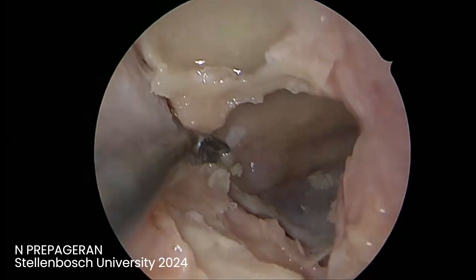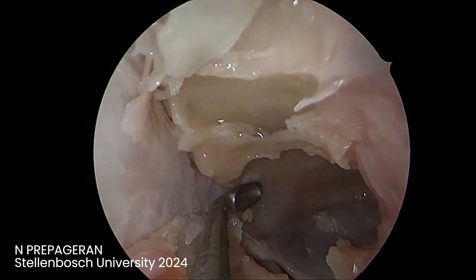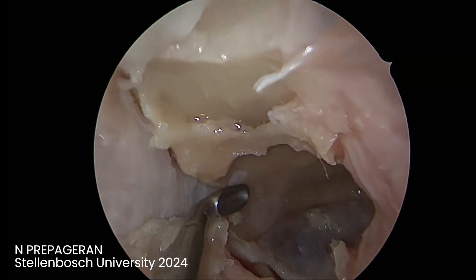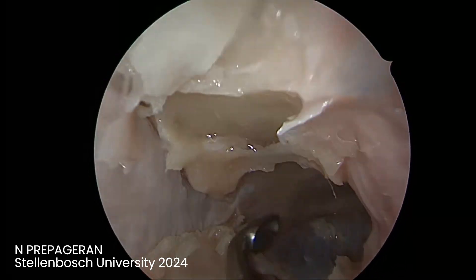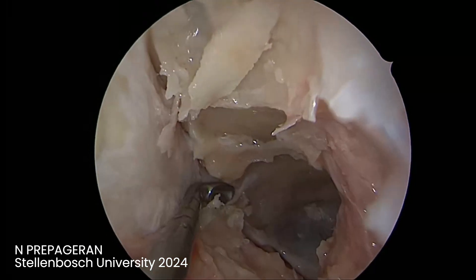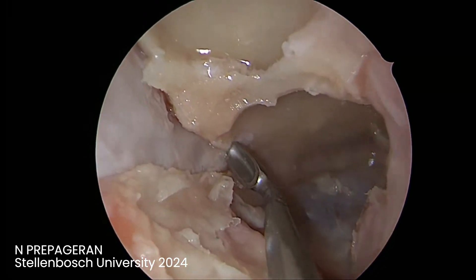Now we are going to decompress this bone that is stuck. Remember, when you do this it's very easy to injure your endoscope, so you have to be very careful. You can see how far I'm keeping my scope. There's a very thick piece of bone here.